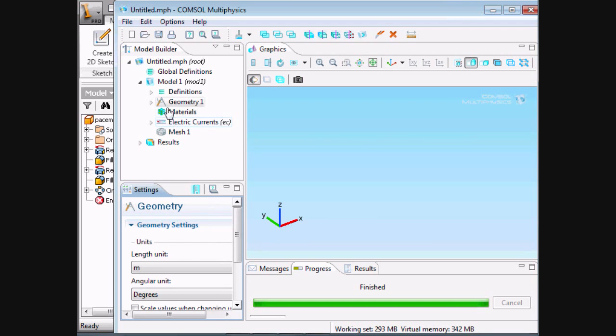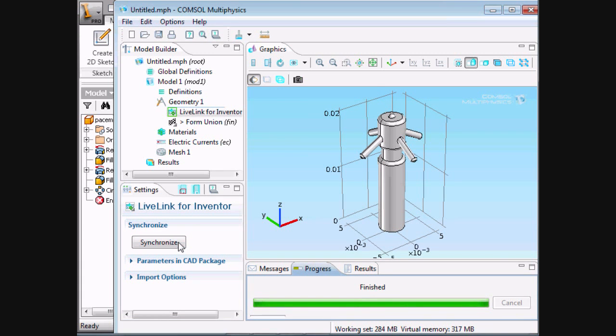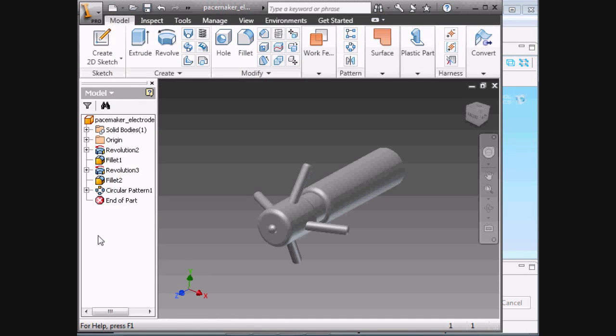And the very first thing it asks us to do is to set up a geometry. We right click and tell it we would like to have a LiveLink for Inventor geometry, and as soon as we click synchronize, it transfers the data across and we get an exact copy of the CAD model as it looks in Inventor.